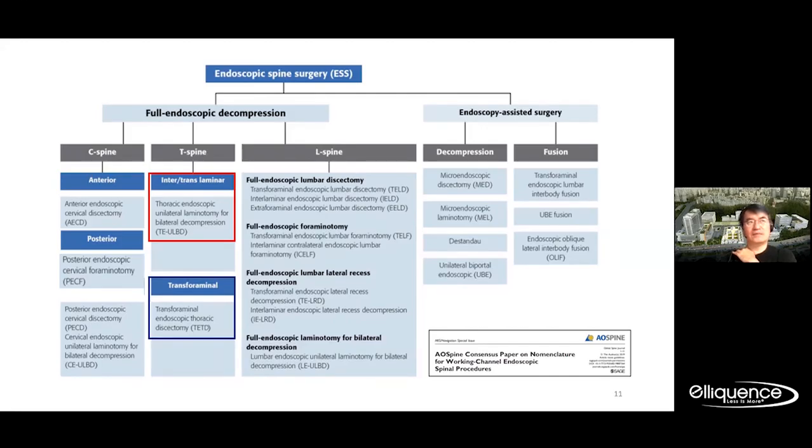Because interlaminar discectomy in the thoracic spine is not accepted well, there is no paper yet, except only one paper by me. So we cannot put the interlaminar endoscopic thoracic discectomy right there.